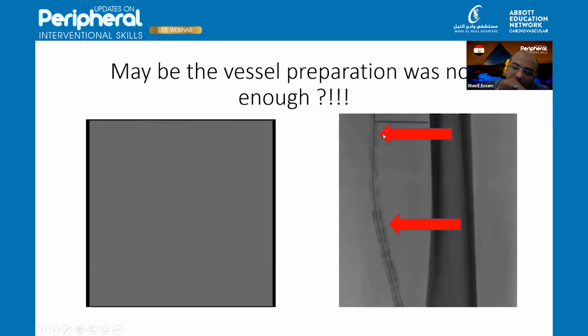That's the same image in here with these two markers. You can see in here, this pin, this radiopaque marker, demarcates the beginning of the stent. Please concentrate on this. The stent in here starts just at the pin, if you can see. But as you can see as well, the stent deployment was not properly done.